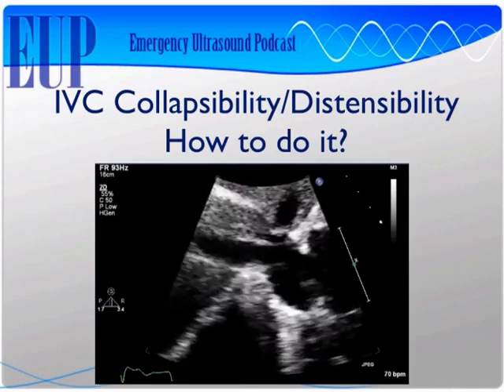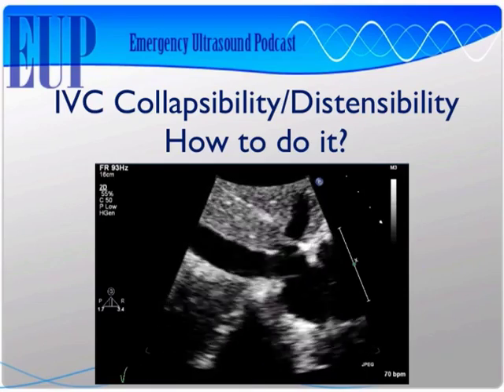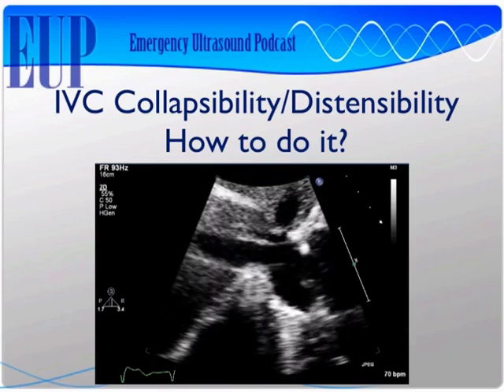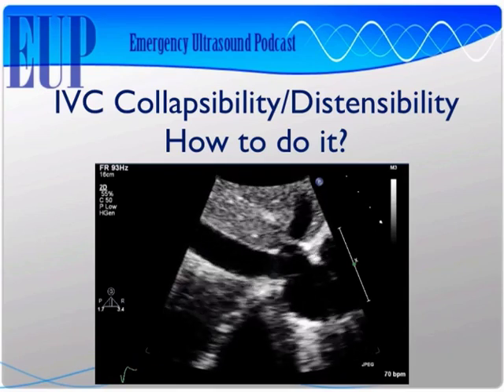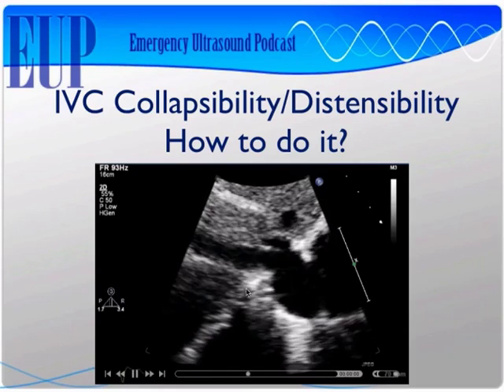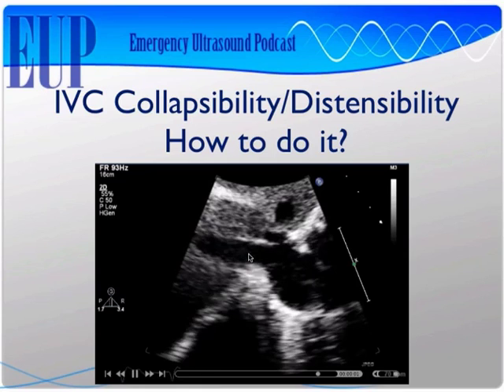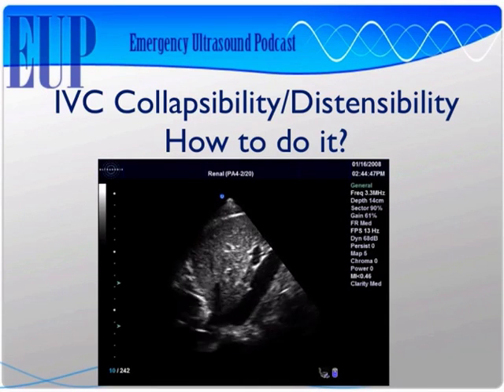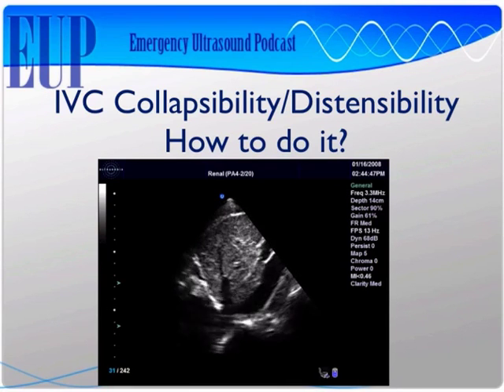So here's an example of an IVC. We're looking at the IVC in long axis here. You can see it dropping into the right atrium. We're actually zoomed into the IVC on this image just to give you a good view of it. And the important part of the IVC is right there, just distal to the hepatic vein. So right in this area right here, just distal to that first hepatic vein that comes off the IVC. Here's another example of an IVC, and we're watching this one right under the heart. So another long axis view, looking at the IVC.